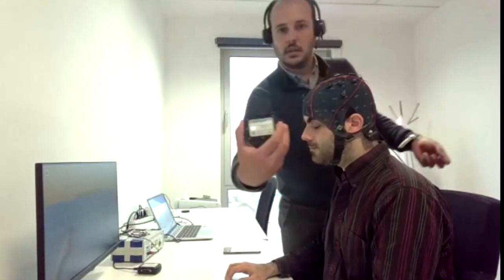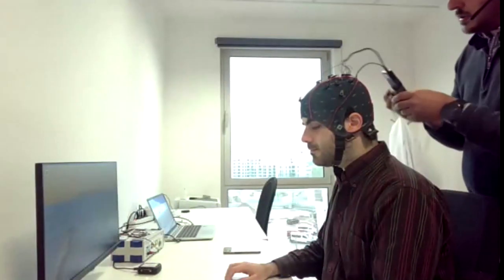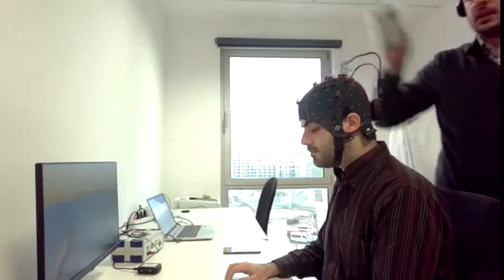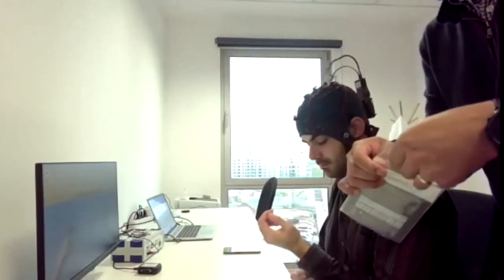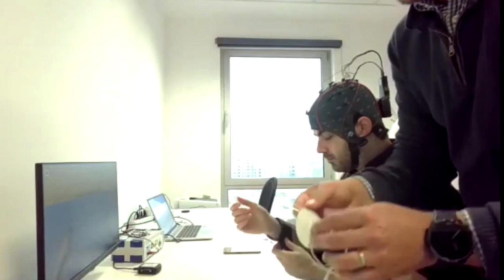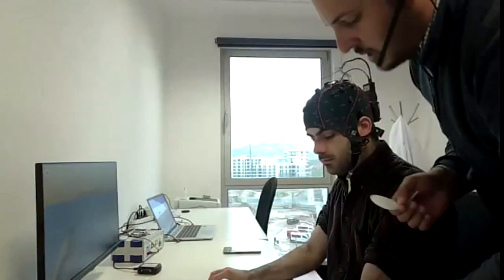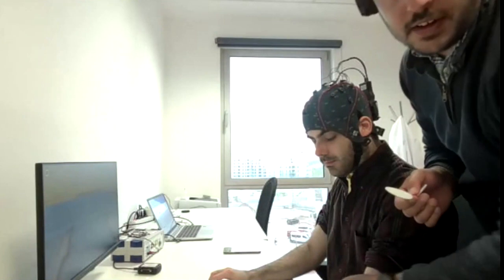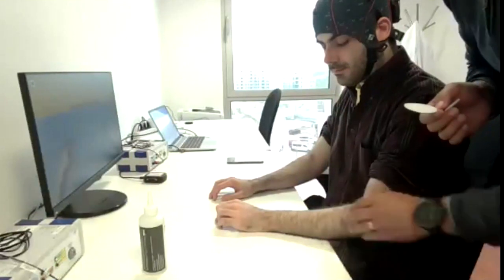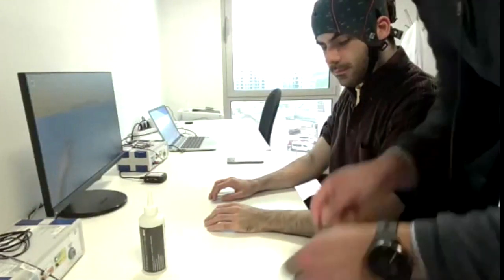Okay, this is the Nautilus amplifier that is plugged onto the electrode cables. So here we have the electrodes for the hand therapy. They are smaller than the ones that I showed you before because the muscle that we are trying to stimulate is smaller anatomically. If the patient has a lot of hair on the forearms, sometimes we need to remove this hair, but it's important to clean the skin surface before we put on the electrodes with a bit of alcohol.